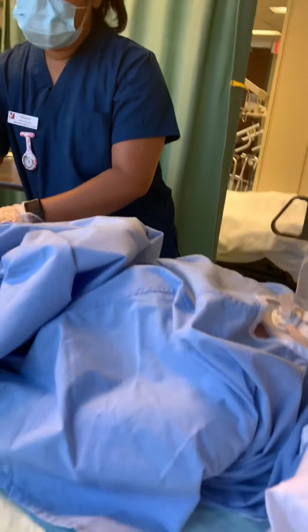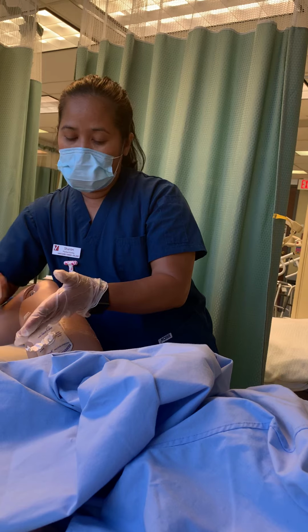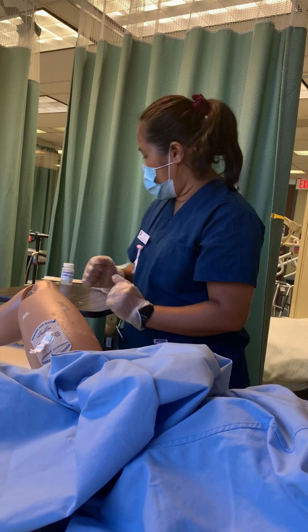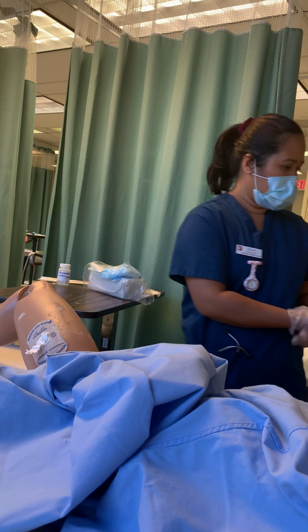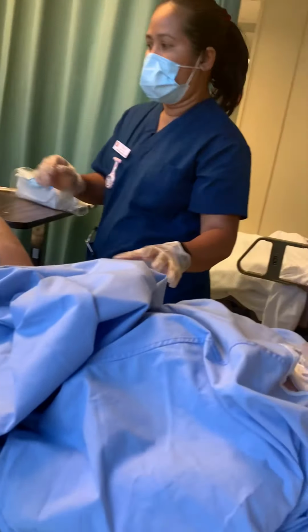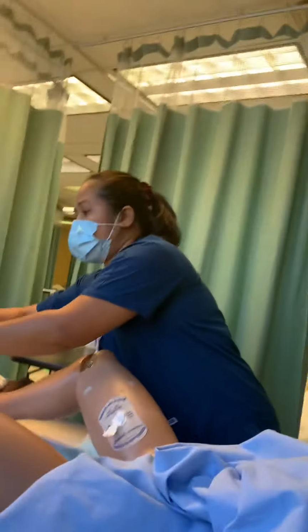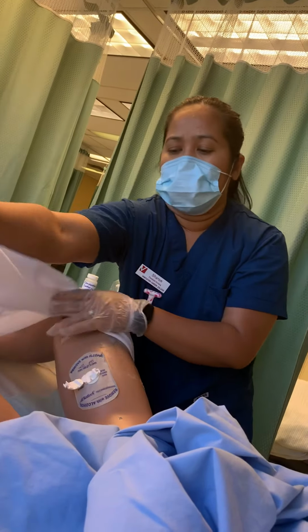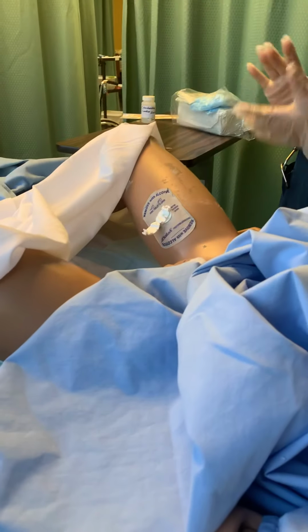You wash the other side, change your towel for this side and then the middle. Always change your towel and then pat dry all the time. So I found out that it's good now. Remove my gloves, and I'm getting my stuff ready. Also make sure to cover them because that's always the dignity of the patient. Just expose what you have to do.